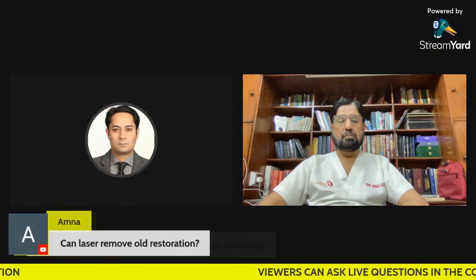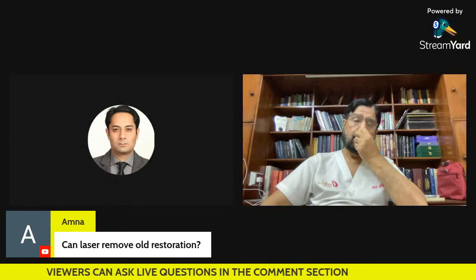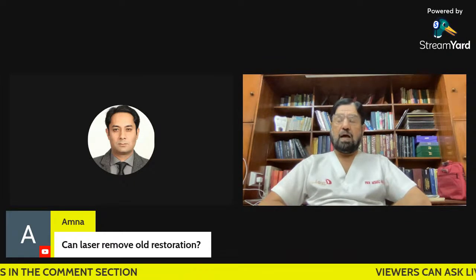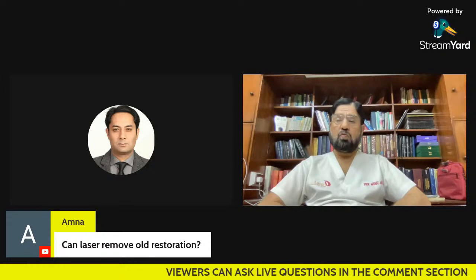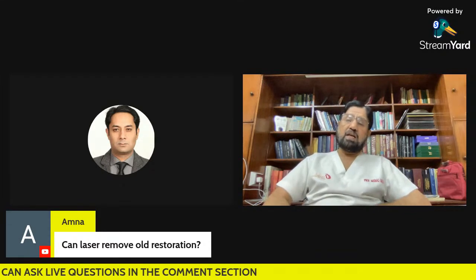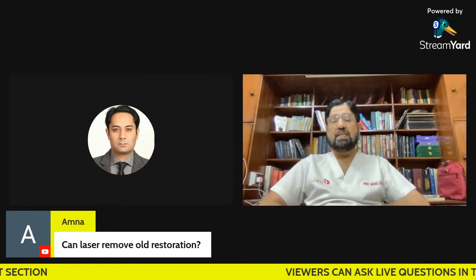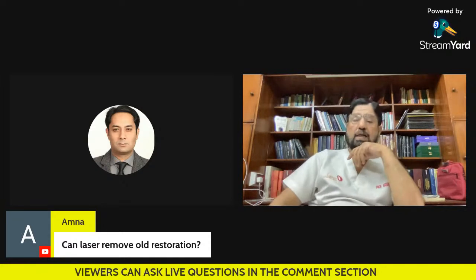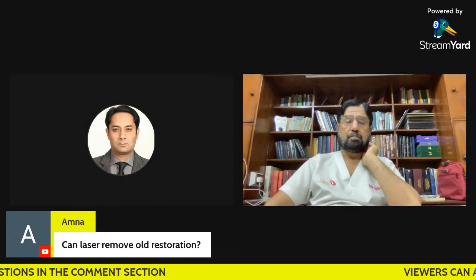Right, sir. Another question: can laser remove old restorations? Restoration removal by the simple laser is not possible, because it requires a hard laser, a water laser, or you can say the Erbium laser. They are capable of removing the old restoration, but not the routine laser. They do not have such penetration that they can remove the hard tissue depth of the restoration. That is sometimes not possible.